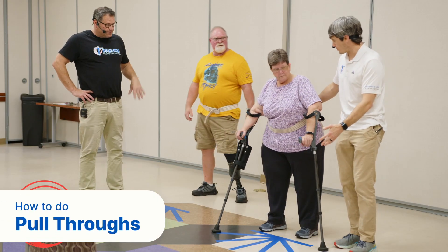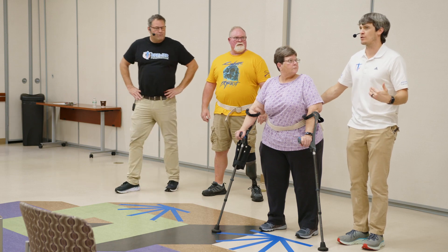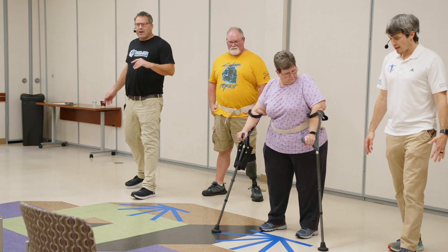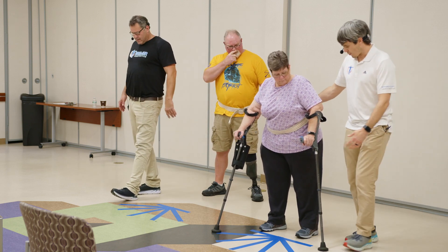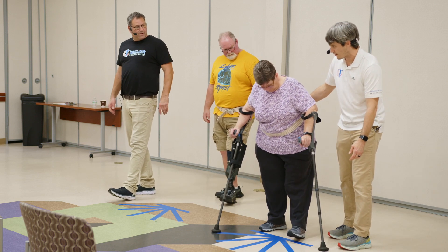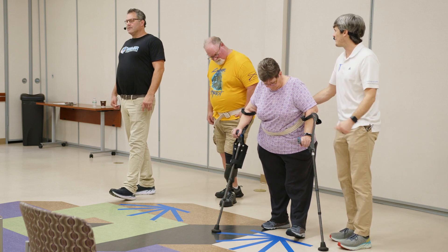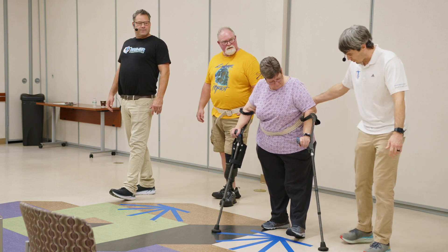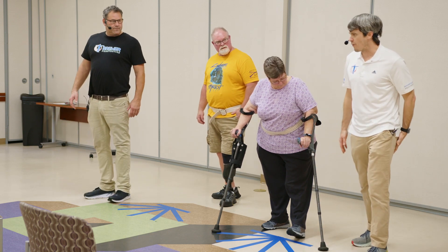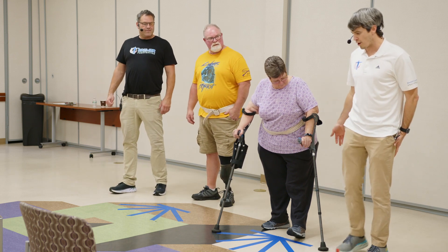These exercises are called pull-throughs and they're very similar to the exercise you just did, but this time you're going to be keeping your weight on your prosthetic side. You're going to start with the heel down. Your prosthetic leg will be just a little bit in front and your sound leg just a little bit behind. If you're bilateral, it doesn't matter — you've done both exercises already. We're going to focus on using the muscles in the back of the leg that has the prosthesis to pull ourselves through.